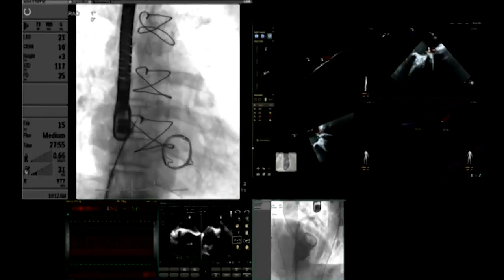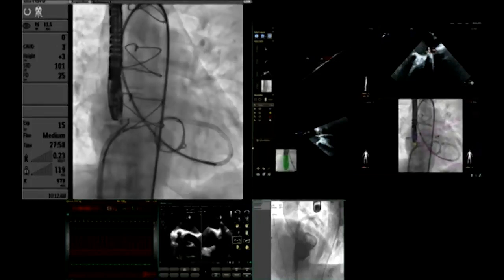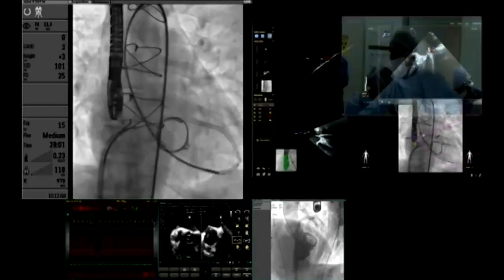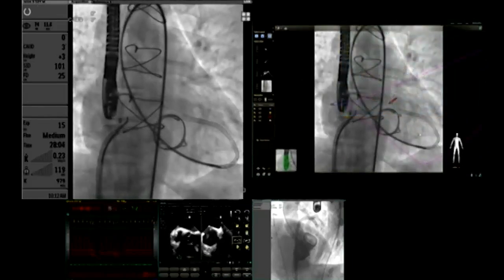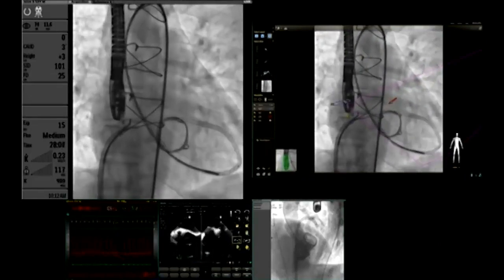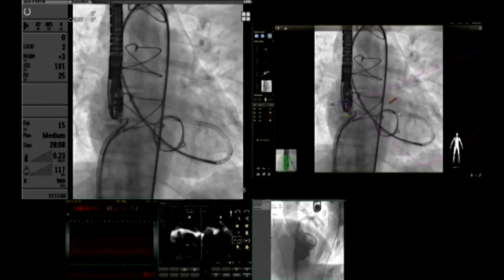The next step was to mark on the echocardiography. You can see on the right side of the screen the fluoroscopy. This is echo navigation with the superior vena cava–atrial junction marked, the intra-atrial septum marked, the left atrial appendage marked, and the paravalvular leak marked — all marked on echocardiography and fluoroscopically with dots on the fluoroscopy.